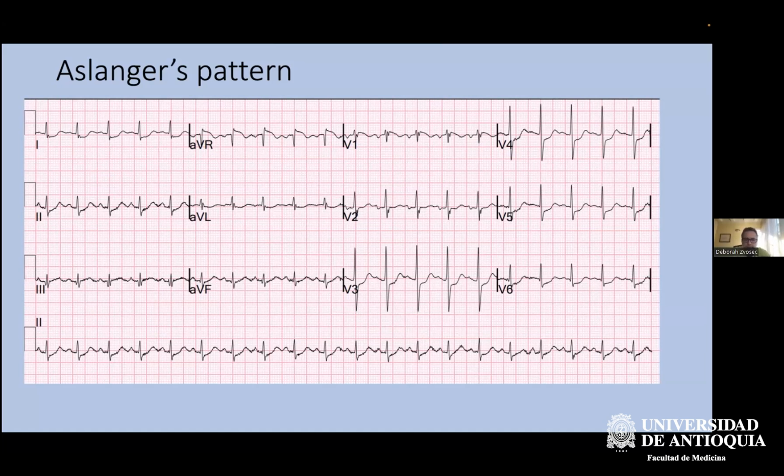Yeah. So the algorithm was taught based on a group of patients which partly come from my institution, Hennepin County Medical Center in Minneapolis, and a lot of them were African Americans, a lot of them were Latinos, a lot of them were white. So it was a diverse group, and it was also tested on a group from my hospital, so it was a diverse group as well. And the FDA had all these questions too, and we were able to answer them to their satisfaction. Now, it'd be much better if we had even more data from you guys, from Colombia. That would be fantastic if you wanted to study it in your population.